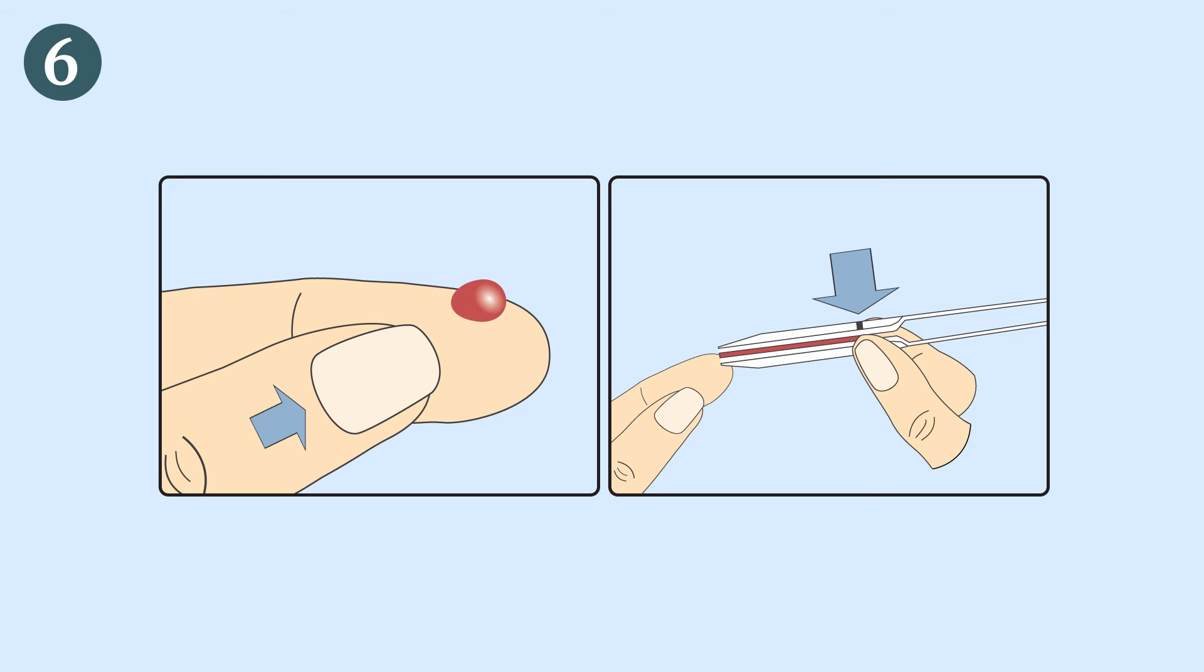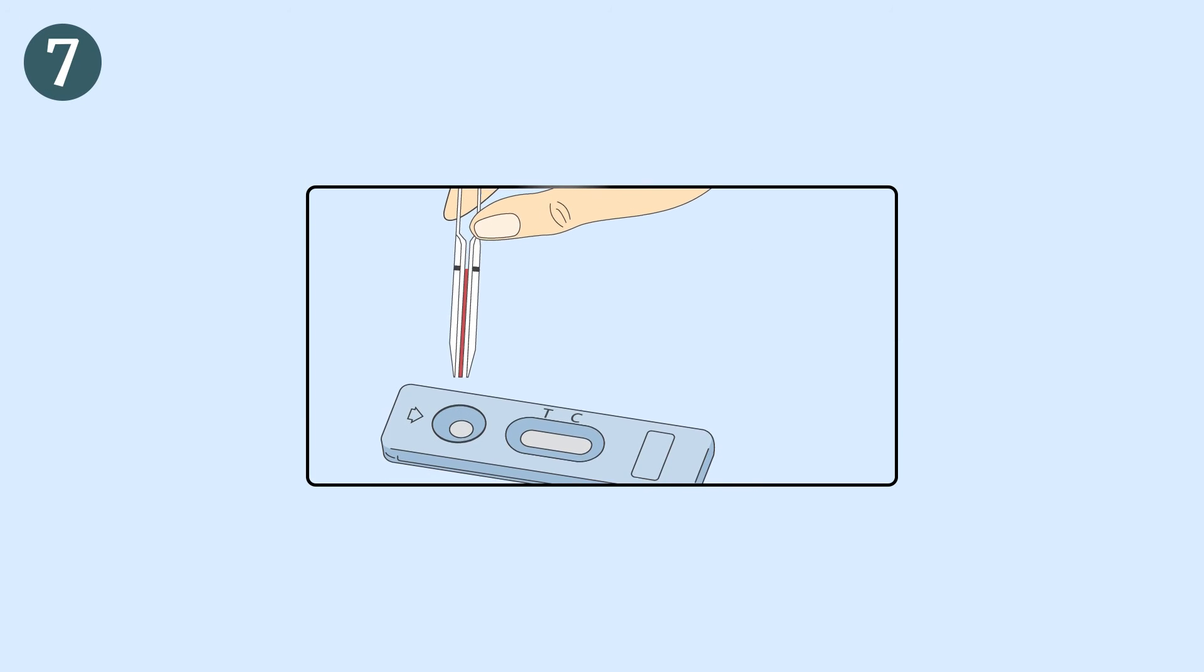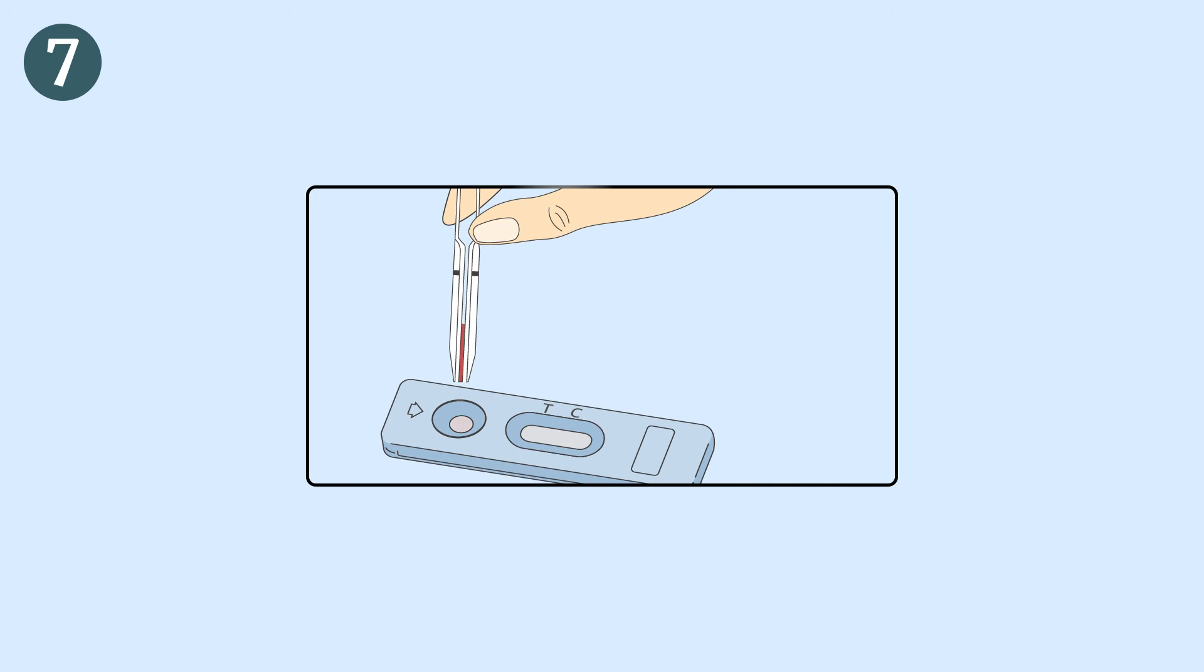As far as possible, avoid air bubbles. Put the blood collected with the pipette into the sample well of the device by pressing on the pipette bulb. Wait 30 to 40 seconds for the blood to be totally absorbed into the sample well.